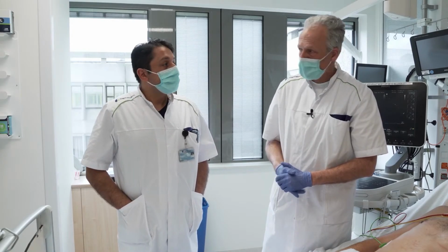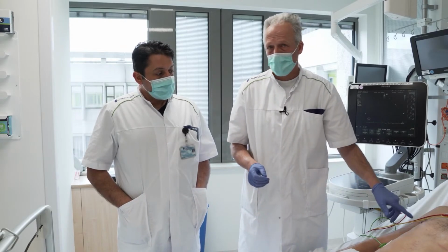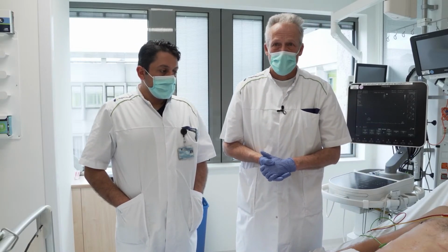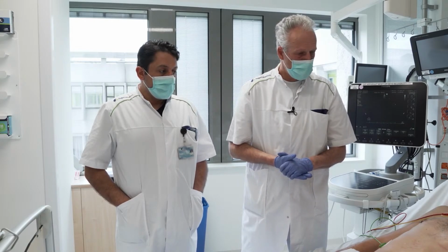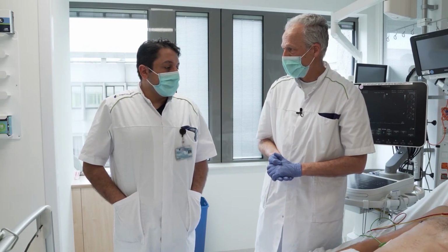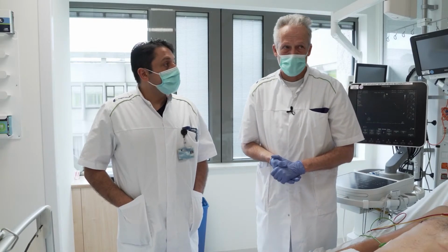Thank you very much. Oh, I have an addition, sorry. If you decide to put in a chest tube, I think you should also use the echo because you want to be sure that you put it in above the diaphragm. That's a good thing to do. Also, if you should choose to do a pericardiocentesis, you can probably do the subcostal four-chamber view. Absolutely, absolutely. You can use it also not only diagnostically as we now showed, but also therapeutically. Echography is very useful in pericardiocentesis or thoracic tube placement.